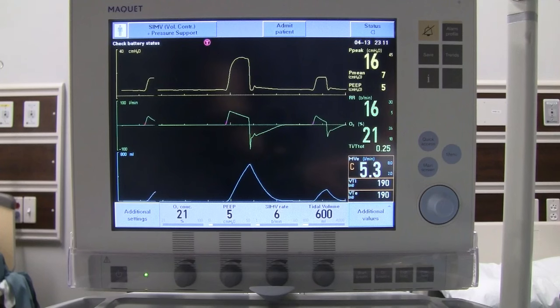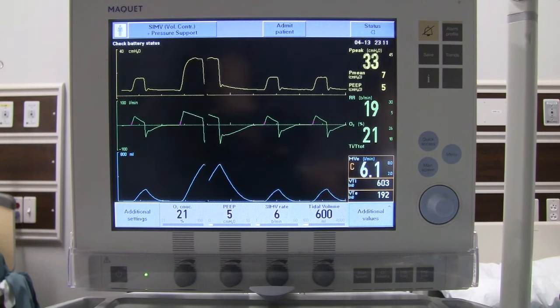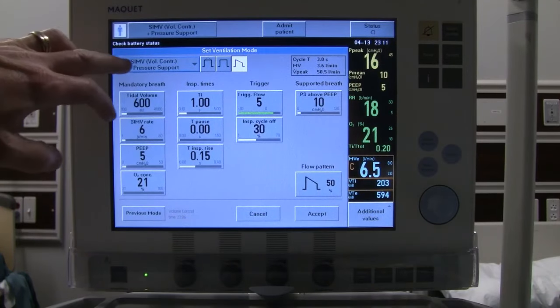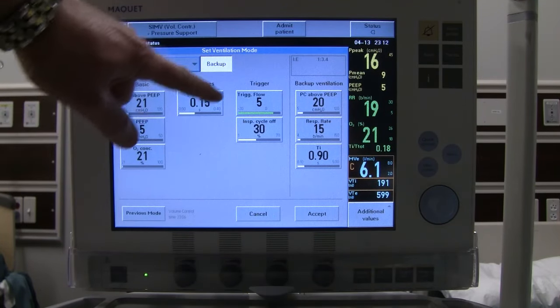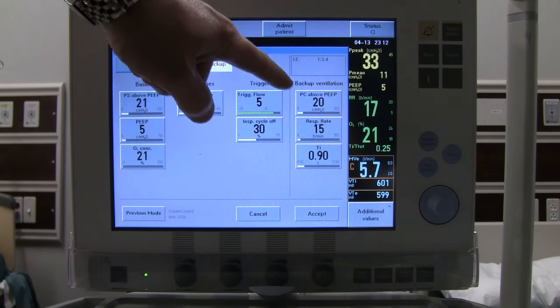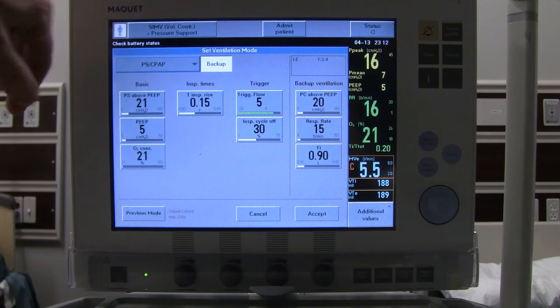Now our patient has been breathing on SIMV for a while and their condition has improved enough that we want to let them breathe completely on their own with just a little pressure support. So we'll go to full CPAP with pressure support. Go back into the mode screen and select pressure support and CPAP mode.